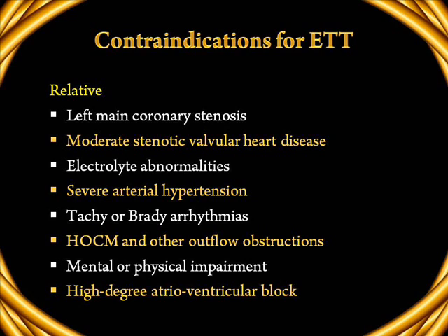ETT. Tachy and bradyarrhythmias, hypertrophic obstructive cardiomyopathy, HOCM, or other outflow tract obstructive lesions, mental or physical impairment which will preclude exercise testing, high degree of atrioventricular block. These are some of the relative contraindications for ETT.